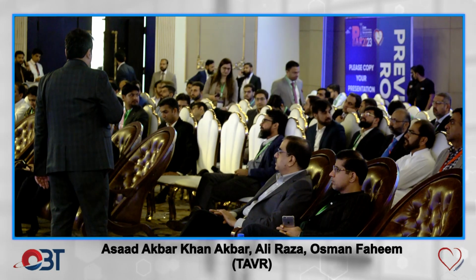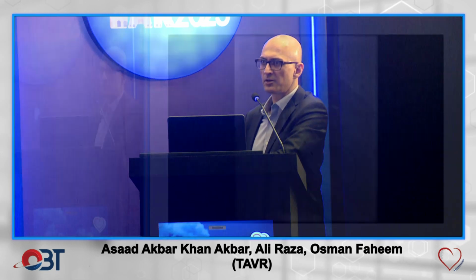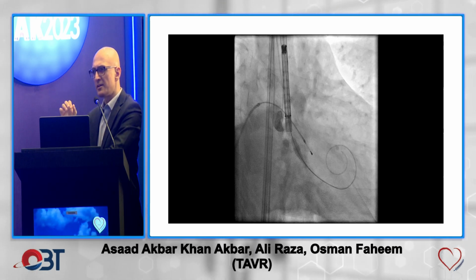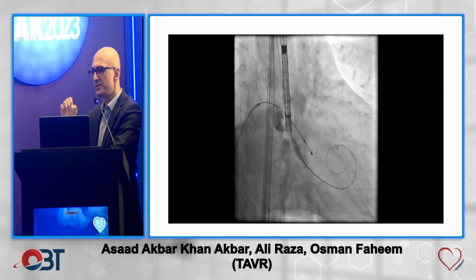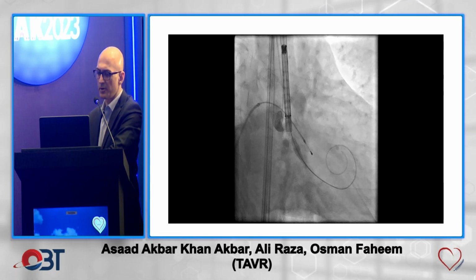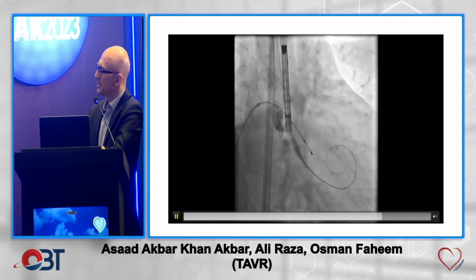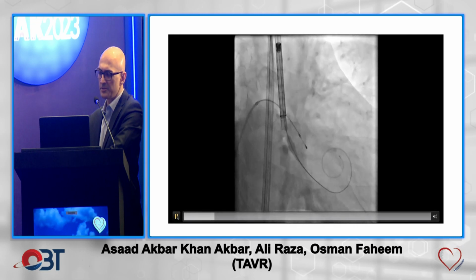Okay. So with this patient, I'm showing the second deployment. The first one, we started off at the middle of the pigtail, and the valve was too high. It looked okay, we hadn't deployed it, but we waited and took another shot after 5 minutes, and it had slightly inched up a bit. Whether that was tension in the system or something else, we were uncomfortable. It was too high, so we redeployed it here. Thoughts on the wire position? I know they say pull the wire back, and we tend to pull the wire back, although I'm not as aggressive about pulling it back as maybe some other operators.